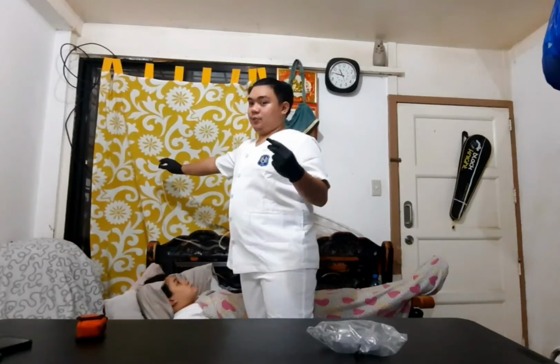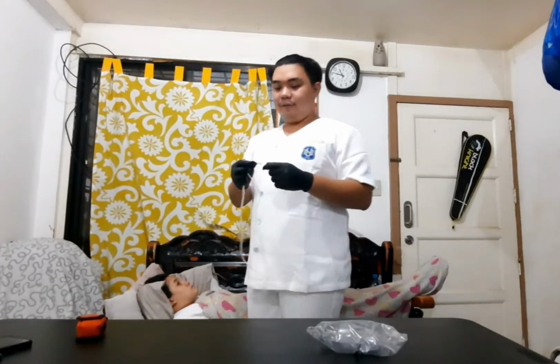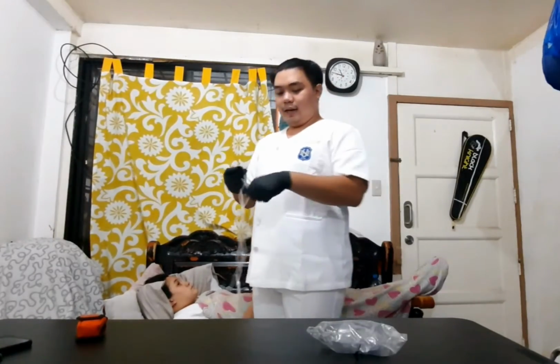Assuming there is a flow meter attached to this wall, check if there are no kinks and the airflow is right. You need to check that the oxygen is flowing freely through the tubing, there should be no kinks, and the connections should be airtight.